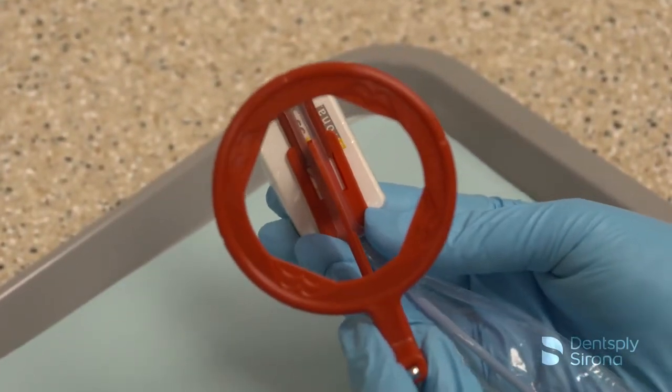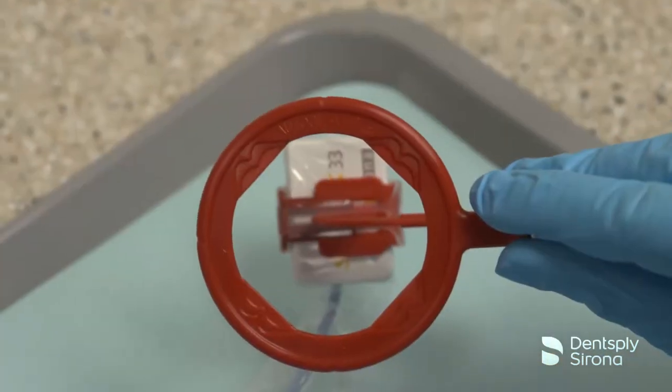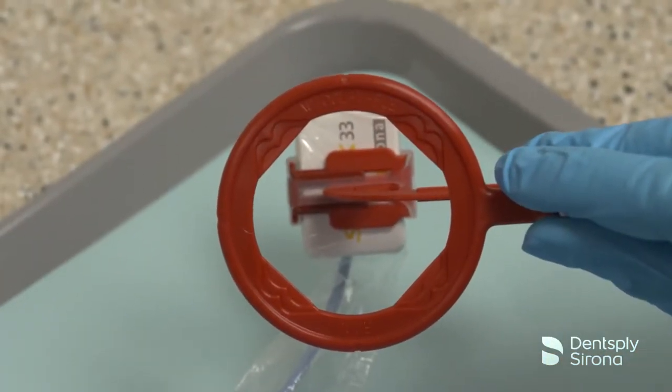If taking horizontal images, the sensor will be placed into the bite block in the horizontal position and in a vertical position if capturing vertical bitewings.